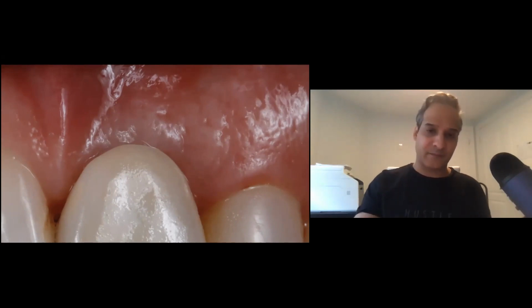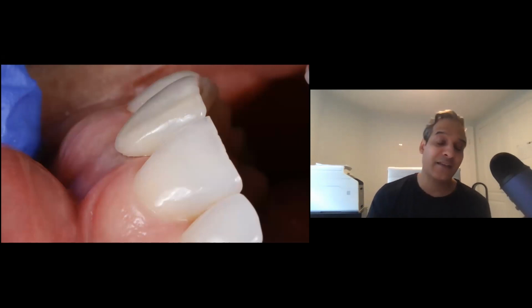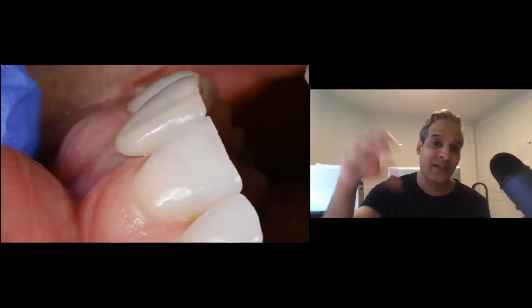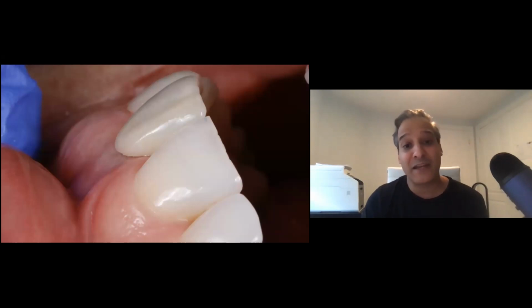She's like, I just don't like the way it looks. So upon further investigation, you can see how the implant or the restoration itself has a ridge lap. It's like an overhang. So now you can see when light hits the front of it, it bounces off the tooth and then creates shadowing on the gums.